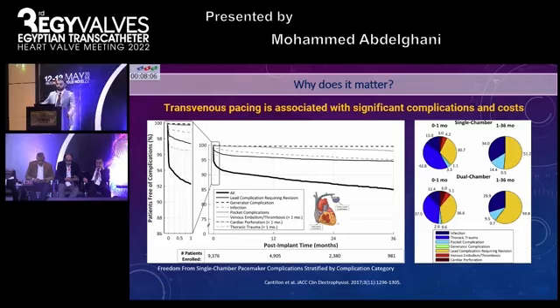And then we run so many studies trying to explore whether pacemakers are associated with worse outcome after TAVI. In my humble opinion, this dilemma is artificial. Pacemakers portend a worse prognosis in the long term. If you wait 5 to 10 years, pacemakers are not so friendly.